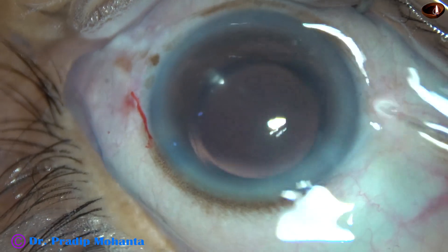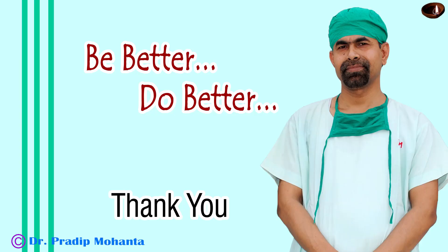All the viscoelastic is removed, the anterior chamber is nicely formed, and the case is concluded. Thank you very much for your attention. Hope this video will give you the idea of how to separate the nuclear pieces when there is a stubborn band on the posterior plate. Thank you very much.